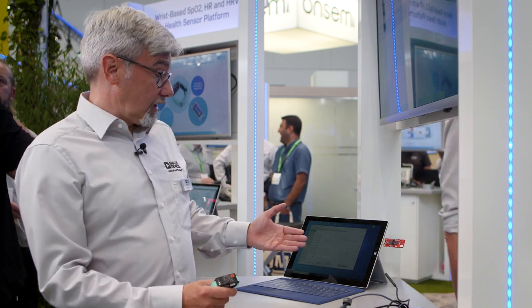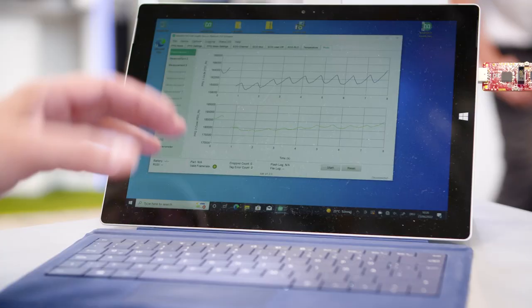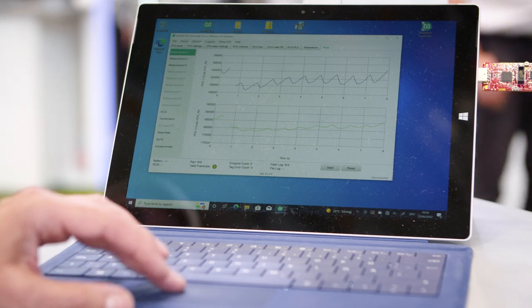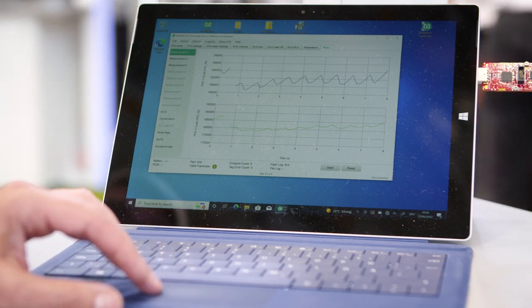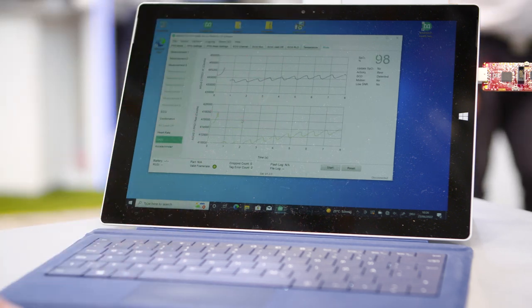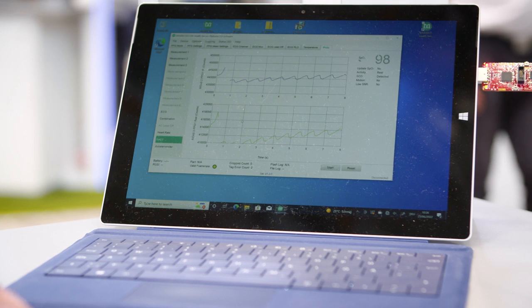Along with the MAX-REFDES104 watch, you also get a GUI running on a PC, and you can start streaming data to your PC and collect it. The GUI has several tabs — here, for example, we stream the raw sensor data supplied to the customer, but we also stream algorithm data like ECG, or in this case, SpO2.